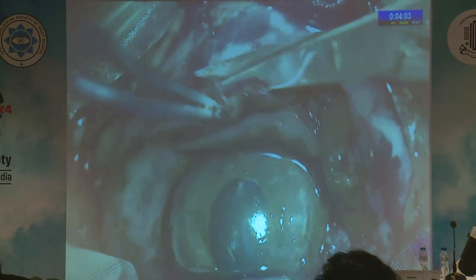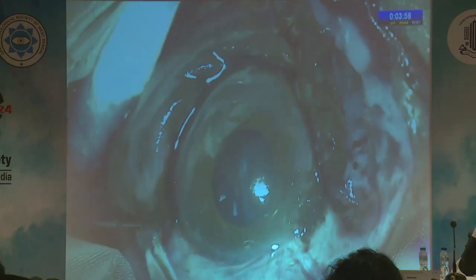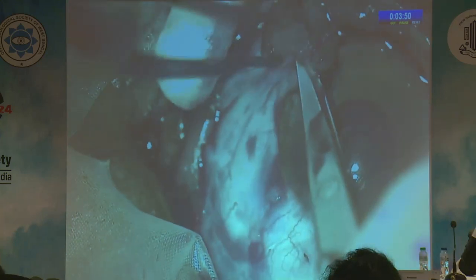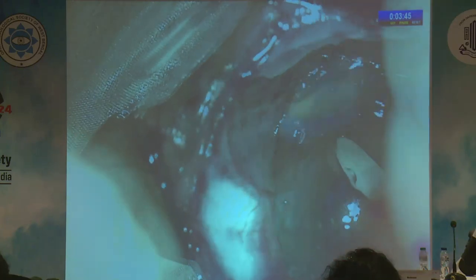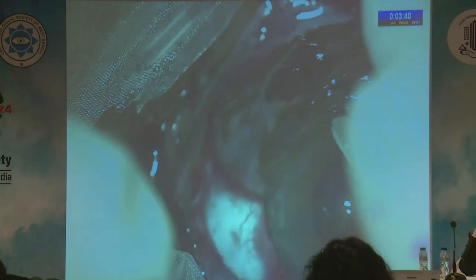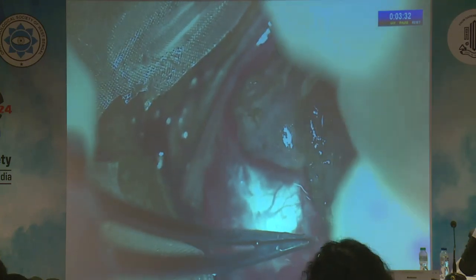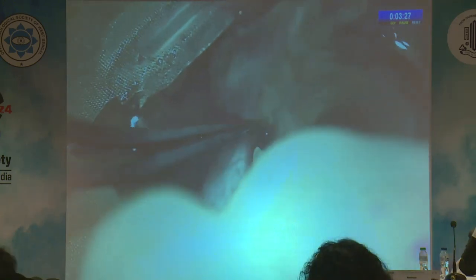After excising up to the inferior quadrant, dissection now shifted to the supranasal area and was extended in a similar fashion to complete it gradually. Dissection of the corneal part began with a lamellar groove incision, made following the corneal margin of the nevus by a splitter blade. Layer by layer, slow dissection was carried out from one side and proceeded gradually with an aim to remove it as a single mass in the same cleavage plane.